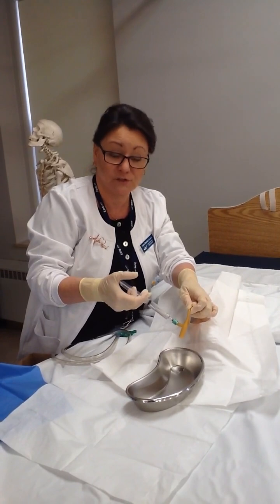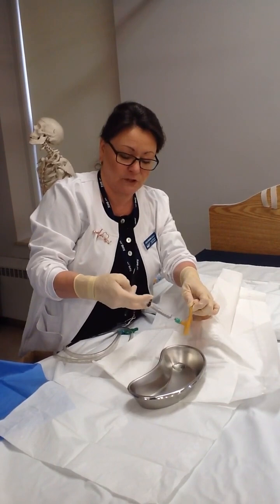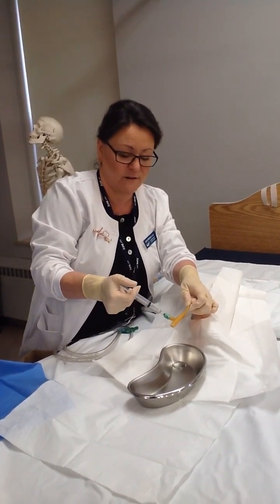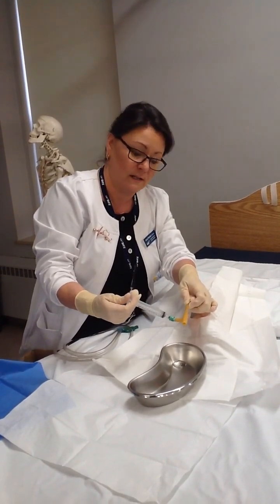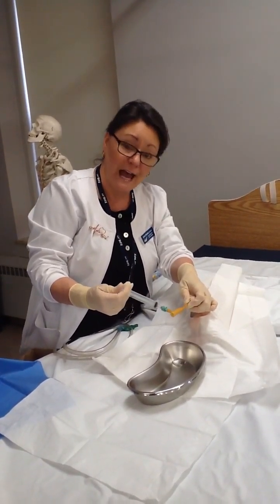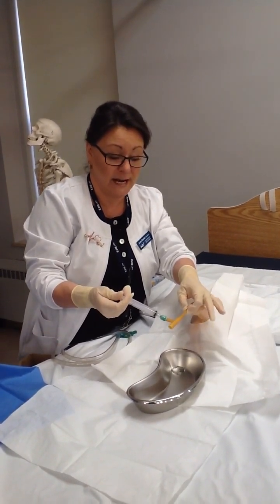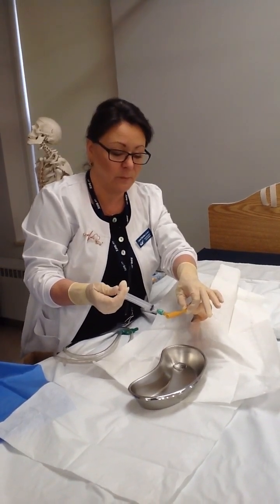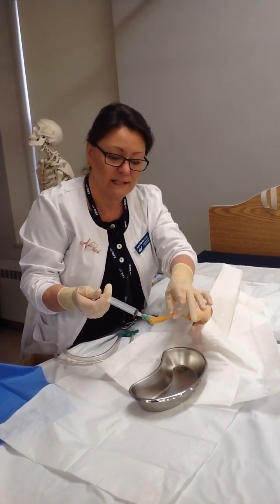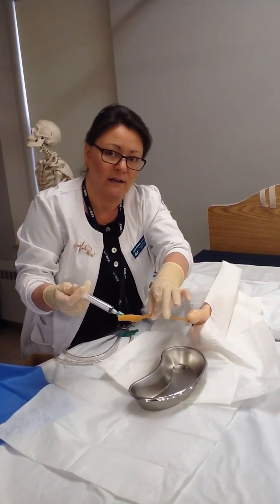I'm pointing the catheter down so that the urine can continue to empty into the emesis basin, and I'm going to inflate my balloon. So it takes a fair bit of pressure to inflate that balloon, and then you've got to keep your thumb on it or it will just release on you. Once I have my thumb down and all of the sterile water in, I'm going to let go and just hang on with my thumb and index finger with my left hand on the catheter, and I'm going to pull out because I want to see that the inflated balloon is caught in the neck of the bladder and is secured there and isn't going to fall out.